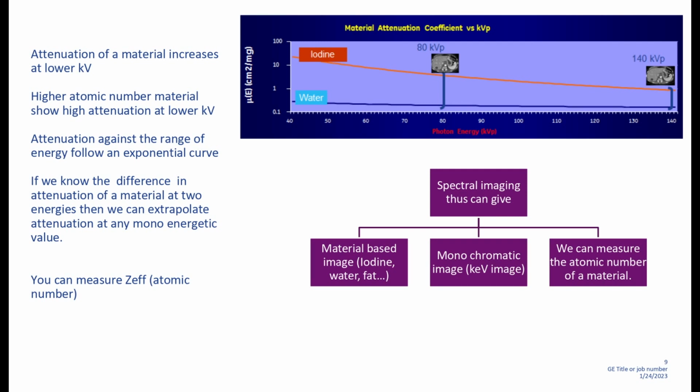Okay, are these postulates fine? Yes, sir. Here, is the X-ray monochromatic or polychromatic for 80 and 140? 80 and 140 are polychromatic beams. What we measure is the peak attenuation values.